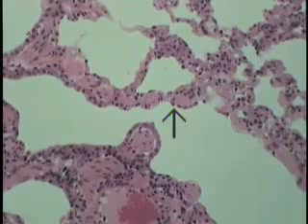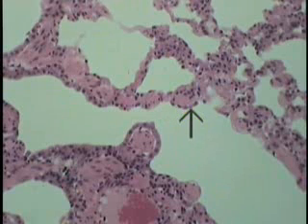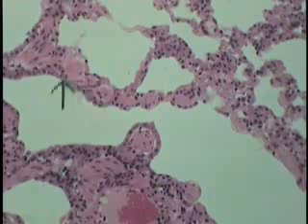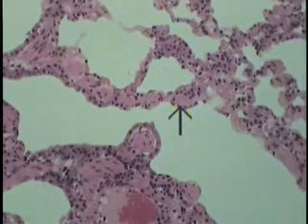In this transitionary portion, that is the respiratory bronchiole, usually the epithelial cells covering the smooth muscle wraps will retain a cuboidal nature and mimic those cells that have lined the terminal bronchiole. So these should show columnar or cuboidal type cells, really.